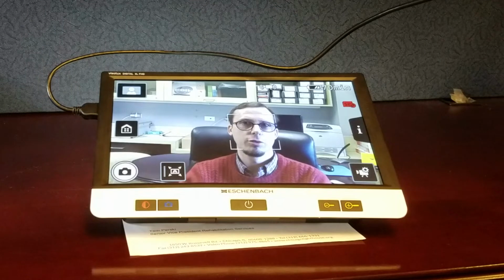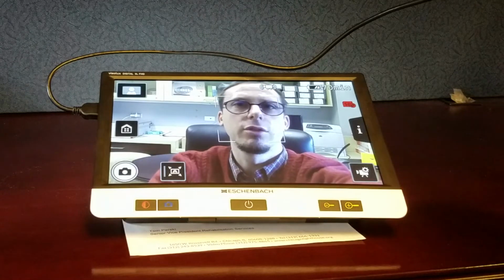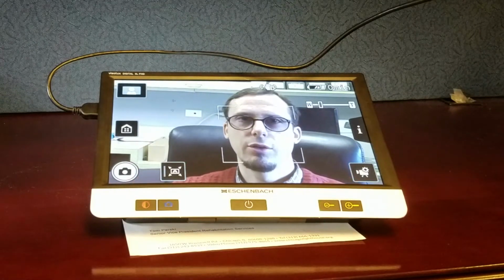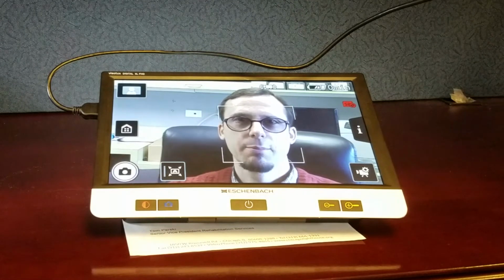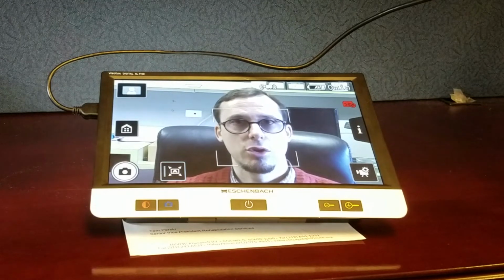So using the controls on the camera, I can zoom in and out. Using the tripod, I can position the camera. I'm going to go ahead and zoom in so we can see what that looks like. Alright, so I just zoomed in and we can see my face up close there, so hopefully I washed properly today. And it's very easy to manipulate and we get a very good clear image.